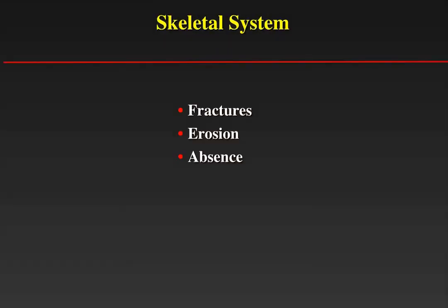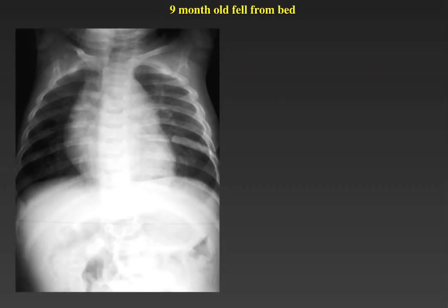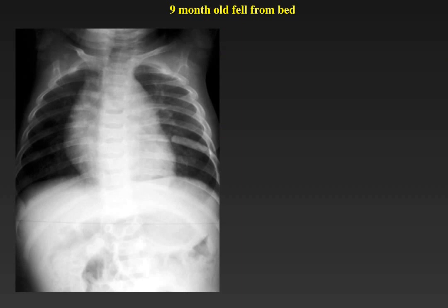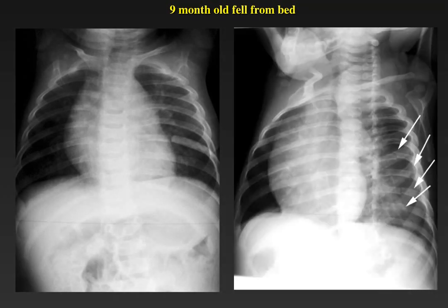The last area we will cover is the skeletal system in the chest. We need to look for fractures, bony erosions, and absence of specific bony structures that may represent either a syndrome or erosion by a mass. Here is a nine-month-old who presented with a history of falling from her bed. Although the chest X-ray looks normal in terms of heart, mediastinum, and trachea, when we focus on the ribs — especially on oblique views — we can see multiple posterolateral rib fractures. The presence of posterior and lateral rib fractures in an infant is highly suspicious for non-accidental trauma.